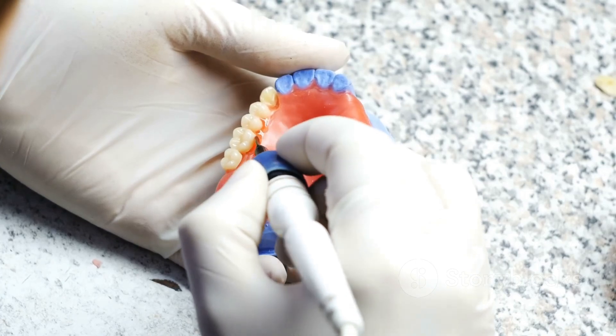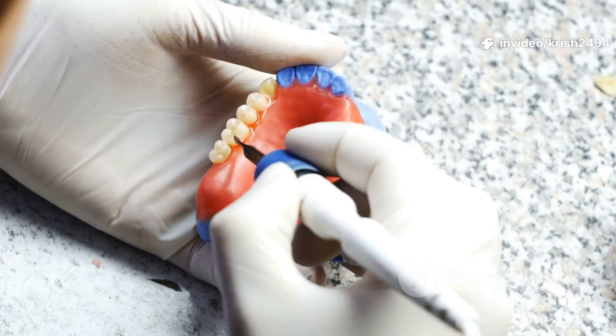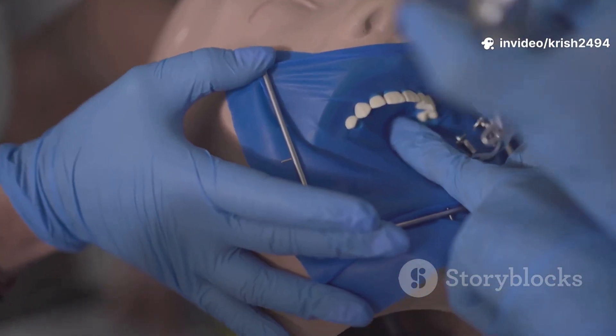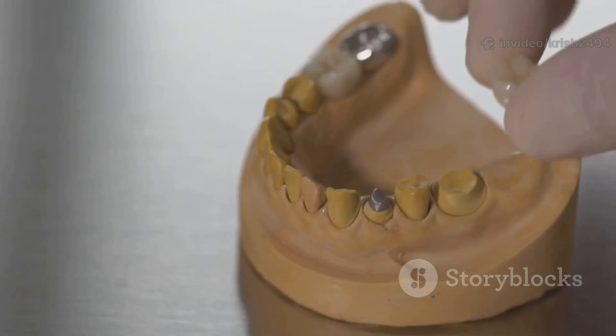Once you give the green light, it's time for flasking and wax elimination. The wax trial denture gets invested in a flask with dental stone, then heated so the wax melts away, leaving space for the real denture material.